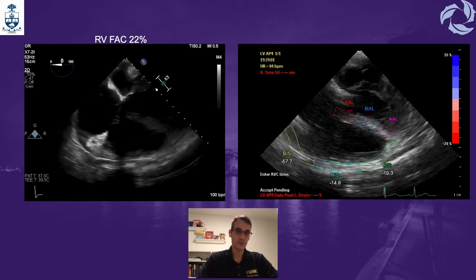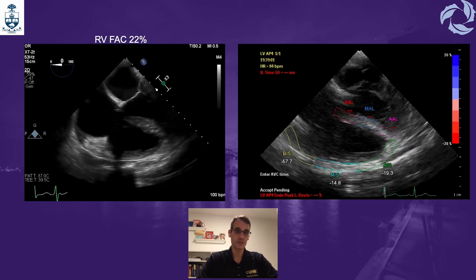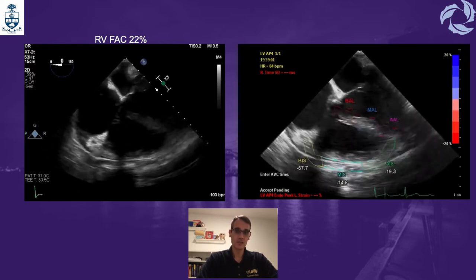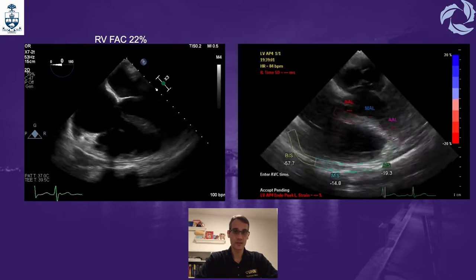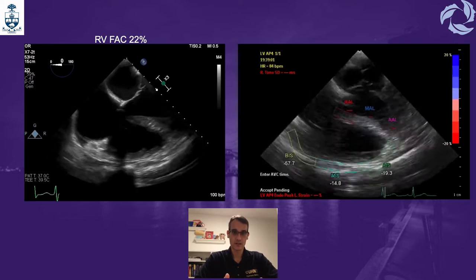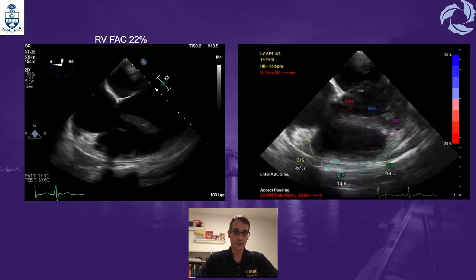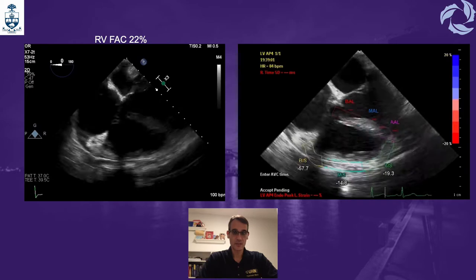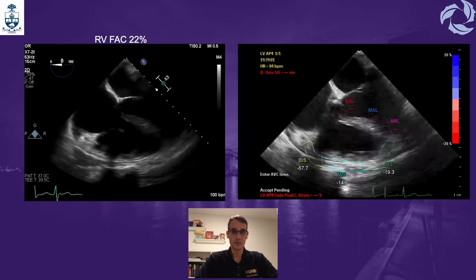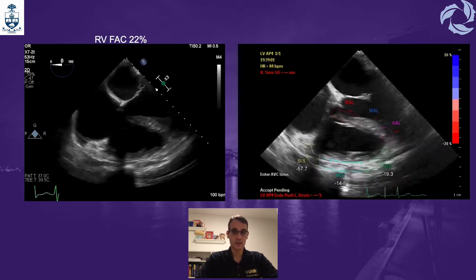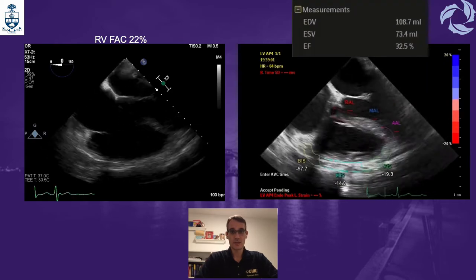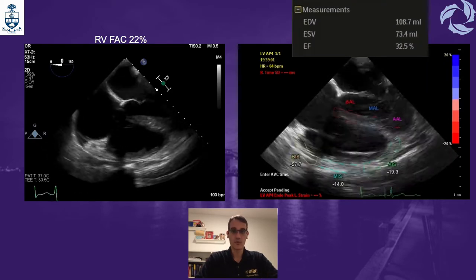Right ventricular function was evaluated by fractional area change, which was 22%, consistent with moderate RV dysfunction. On the right side of the screen, we used right ventricular free wall strain — which is 84% accurate compared to MRI for measuring RV systolic function — using speckle tracking technology. The RV strain was reduced in the mid and apical free walls. Normal values should always be below minus 25%. The calculated right ventricular ejection fraction was 32.5%, whereas normal should be above 45%.